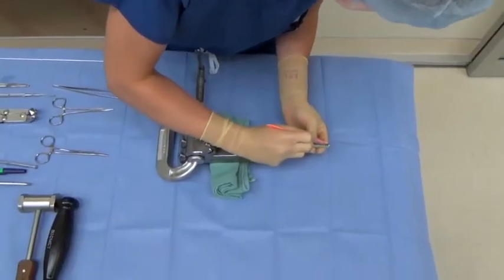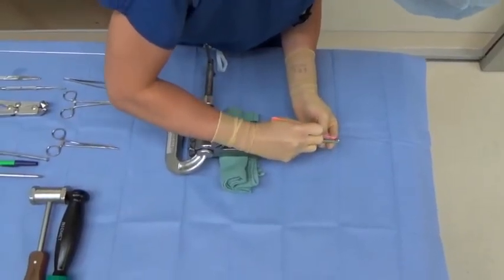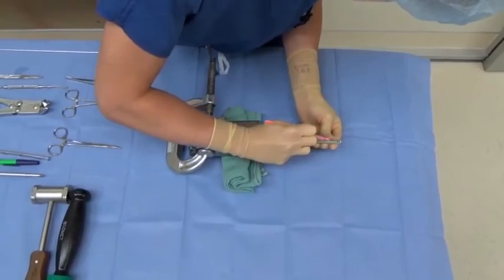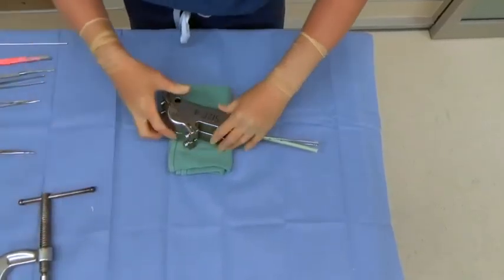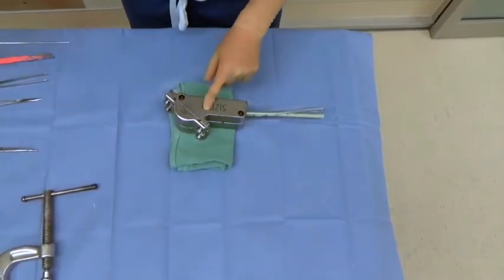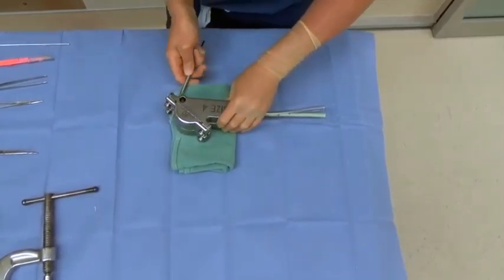After the cement is hard, use a 10 blade and freer to remove the chest tube. Then, remove the clamp and open the mold. You may need to use a humeral head impactor to free the final construct.